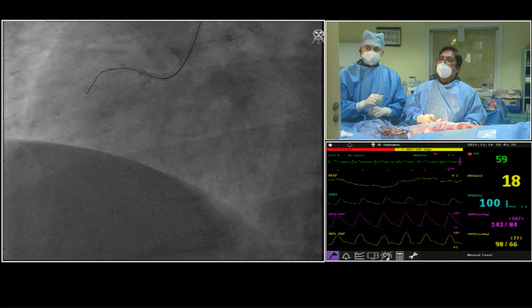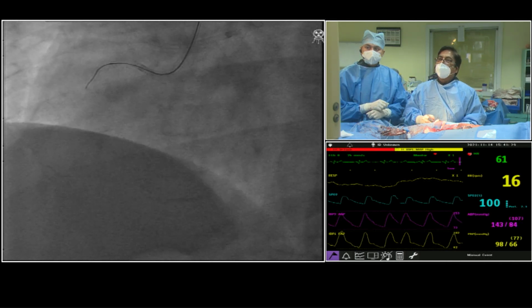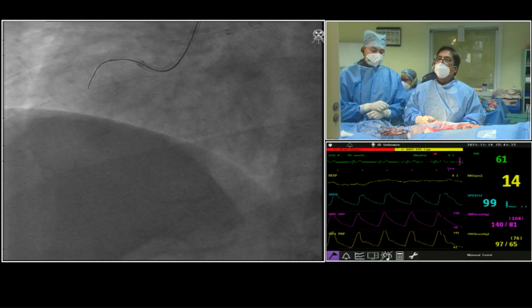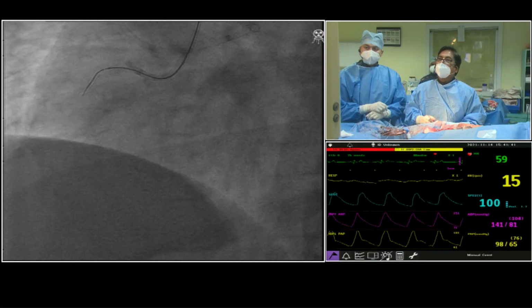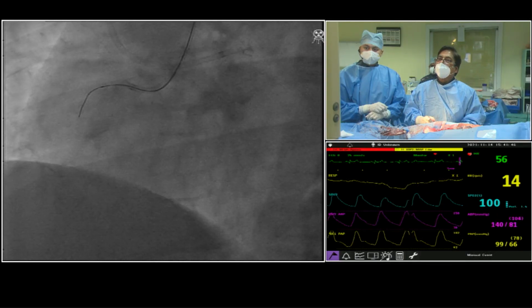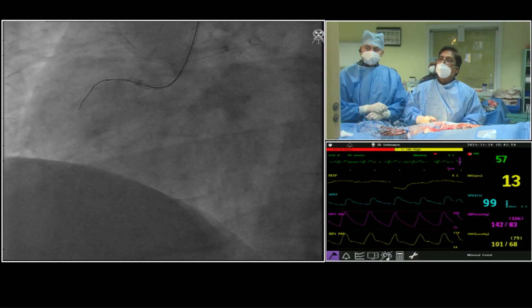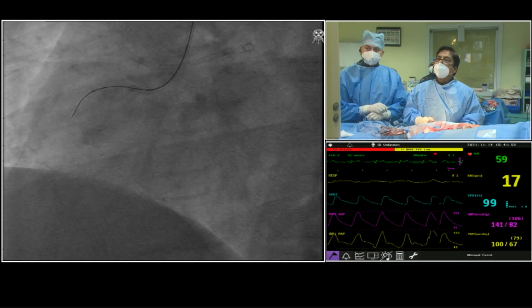Goel sir has actually progressed very nicely now. I personally feel that the only thing is the catheter support is not good. The catheter is backing out a little bit, but he progressed it. So how long would be the strategy of continuing with the chance of crossing, duration 15 minutes, 20 minutes? No. Now he has started moving up. He will not leave it. If it is not moving, then he will take a chance. But the only thing is, if the microcatheter can be moved some more distally, it will be very easy for him. But I don't think that the microcatheter will go down. Yeah, I think probably he is already at the proximal cap with the micro.